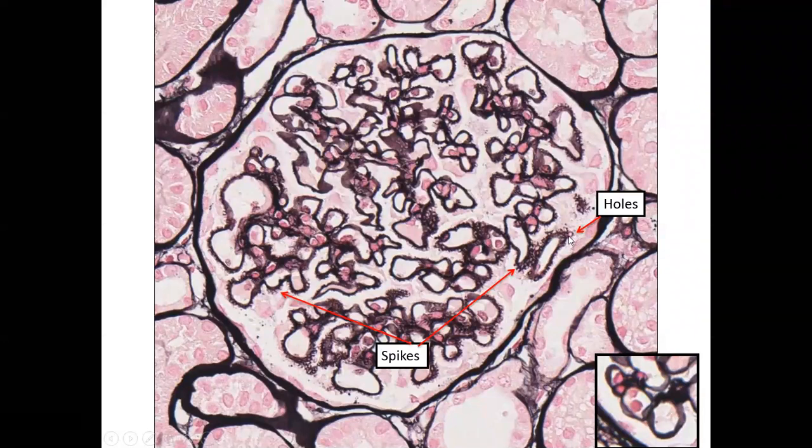A hole is basically when you have spikes, and what those spikes are doing is they are new glomerular basement membrane material, and they're being placed next to immune complexes. So you'll have an immune complex, and then you get GBM to either side. And then eventually that GBM keeps getting placed right there, and eventually it encircles the entire immune deposit. So the hole, this little clear space, represents the immune deposit, and this is all new GBM, glomerular basement membrane material, that has encircled the immune deposit.